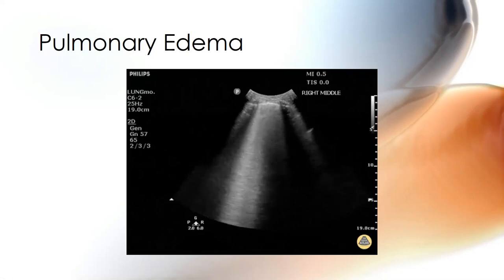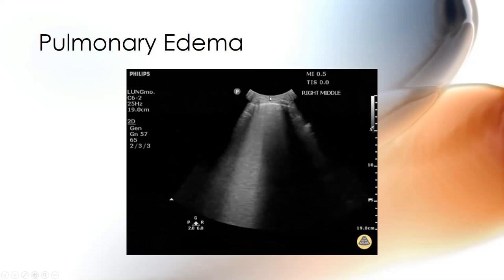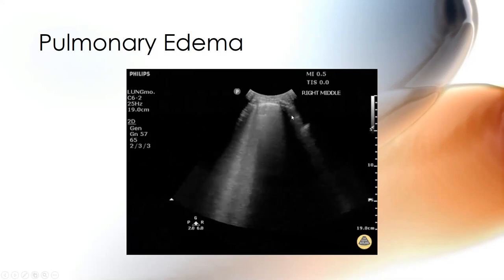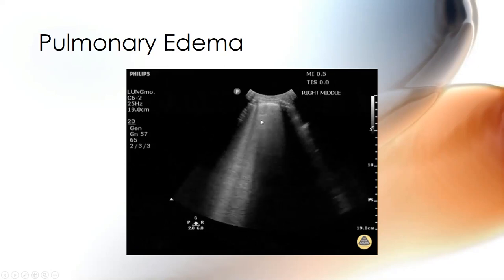Lung point. I don't see a lung point in this particular image. Now, granted, you can zoom in on this, decrease your depth, and really pull in if you're not sure. Remember, you might not see any lung slide when there's rib shadow because you can't see anything behind the rib. But when I'm looking at this line here, that whole line seems to go back and forth and back and forth. So I don't think that I can call a lung point here. What I would like for you to be able to call is presence of B-lines, presence of lung slide, done at this location.